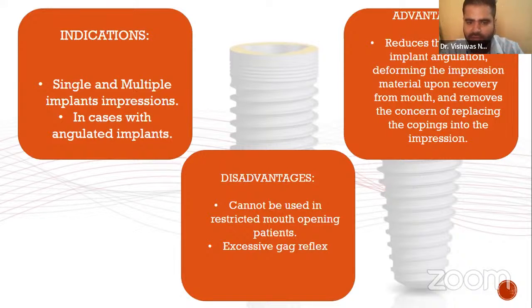The disadvantage of this is that it cannot be used in a patient with restricted mouth opening or excessive gag reflex. Since we know a driver will be used once the impression is set to unscrew the copings, it can lead to a problem with patients who have an excessive gag reflex, or those who have restricted mouth opening. But this technique is considered to be the most accurate. I'll be supporting myself with some studies later.